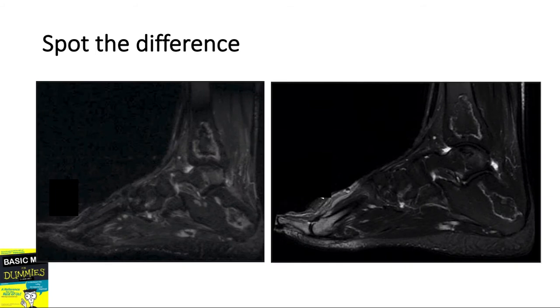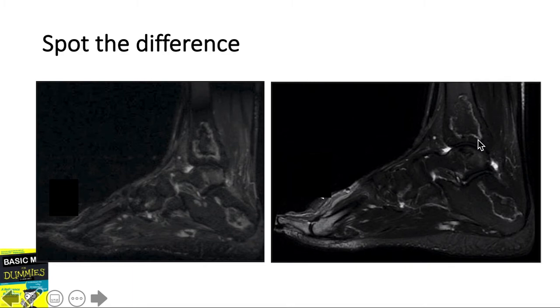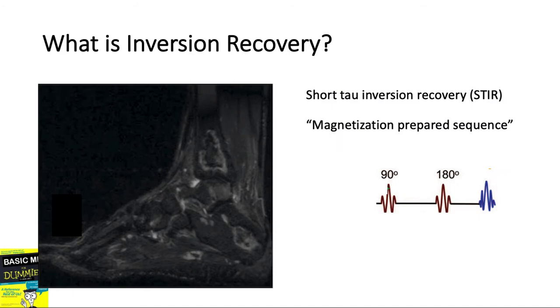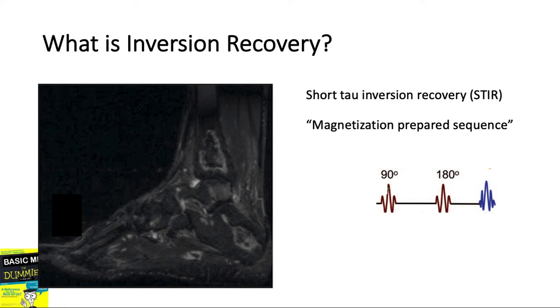These two images are both taken to highlight water or edema. Can you tell the difference, and what can you say about the signal of the subcutaneous fat and the marrow infarcts in both cases? We are familiar with STIR, or Short Tau Inversion Recovery — an image that nulls fat and highlights edema. This is a variation of the spin echo sequence and is what we call a magnetization-prepared sequence.